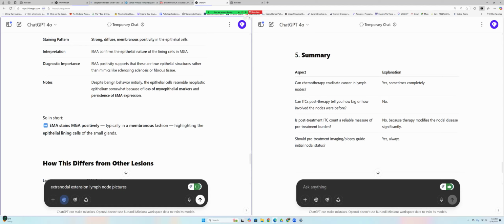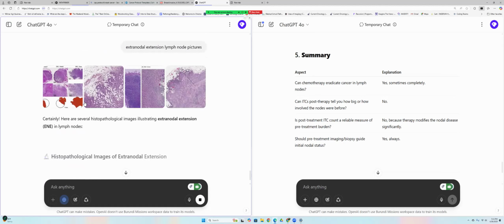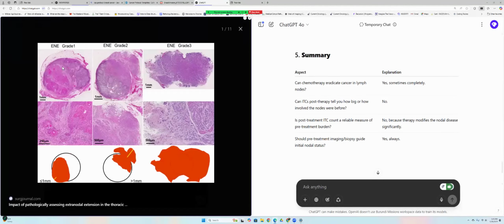So they check that we look at the lymph node. If you're reporting a lymph node, say in this level 1A, 3 lymph nodes out of 10 lymph nodes positive for cancer, largest deposit is 10 millimeters, extranodal extension present. Look at it. This is supposed to be a capsule, but you see tumor extending to this place. This is tumor extending beyond the capsule. Extranodal extension.